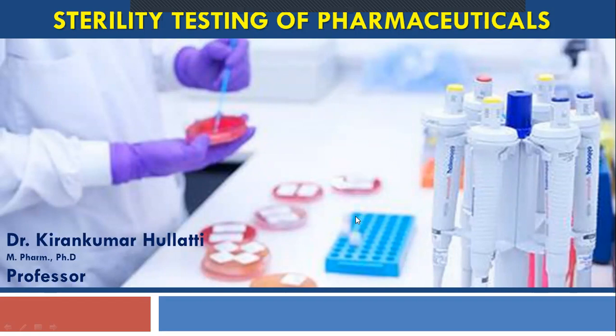And if I tell you in technical terms, whether the product meets the sterility assurance level or the required SAL, whether it is meeting or not, that has to be tested on the product. So after the sterilization, how is this sterility testing done? The principle is very simple.